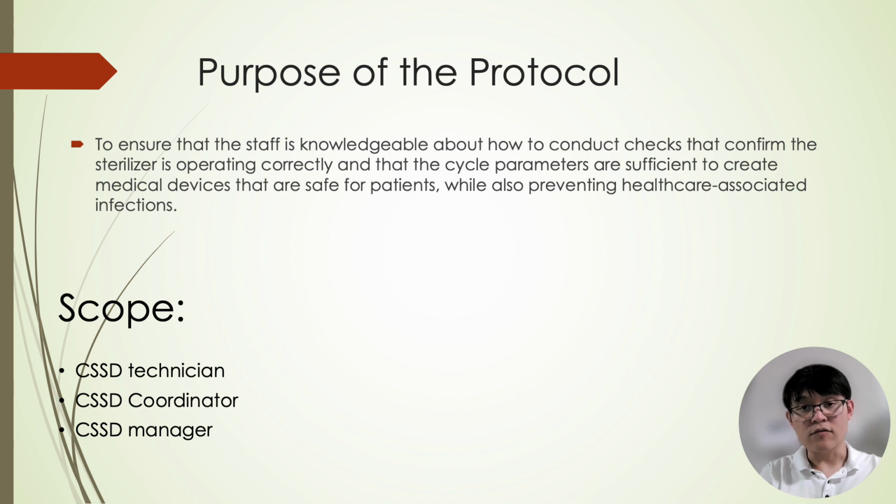Second, who is involved in this process? That would be the CSSD technician, CSSD coordinators, and the CSSD manager.